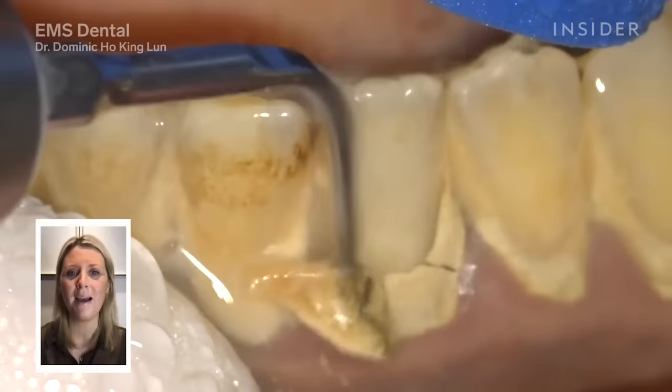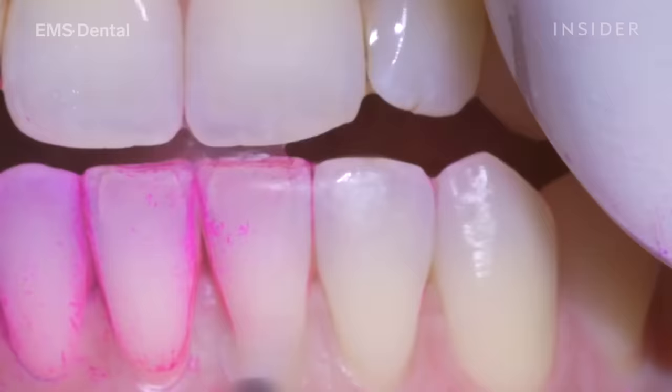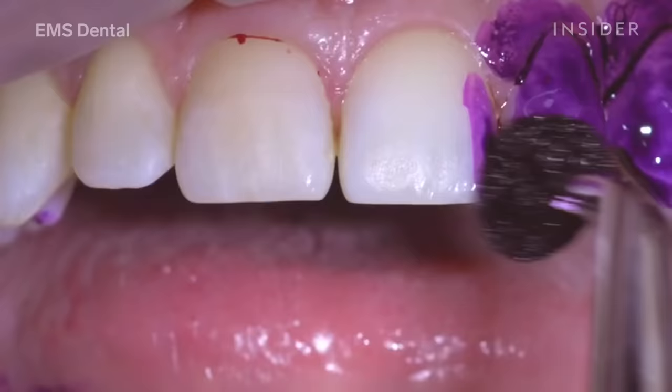Today I'm going to show you how guided biofilm therapy, or GBT, works when we professionally clean a patient's mouth from start to finish. My job as a dental hygienist is to detect and treat, but most importantly prevent, periodontal disease.